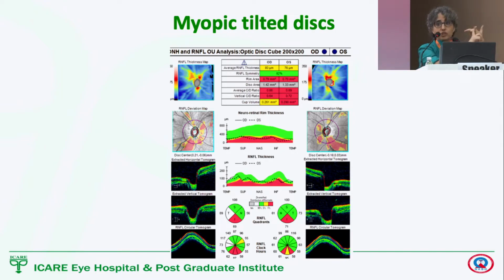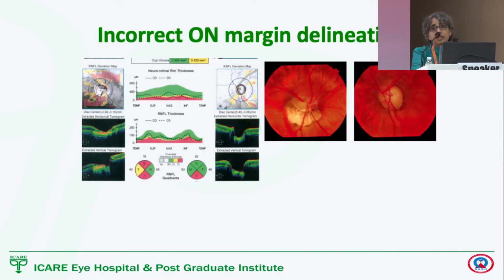In myopes, you have all kinds of problems. You can have low tension disease. You can have discs with very shallow cups and peripapillary changes not allowing you to pick up neuroretinal rim loss, notches, and RNFL is difficult to pick up because of the tessellations. So OCT can be helpful to create a baseline and follow up on that. And sometimes very typical defects, like this wedge, can highlight glaucoma in these eyes as well. But these are challenging eyes.